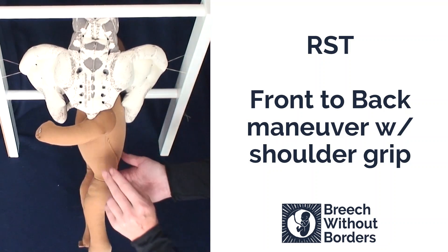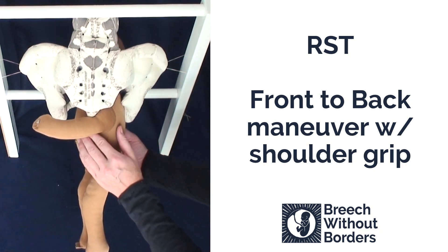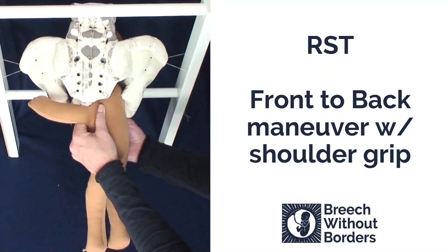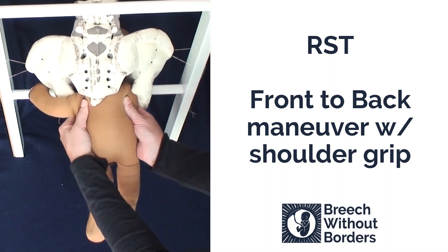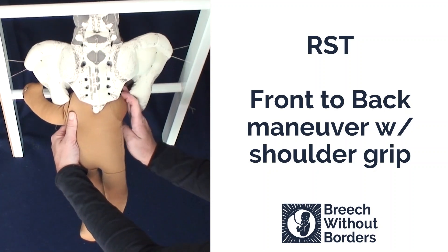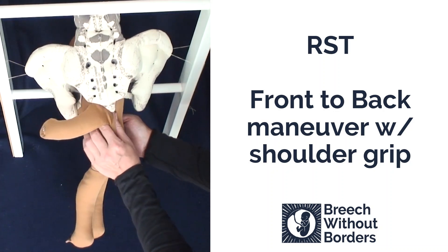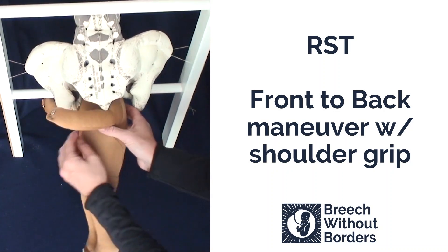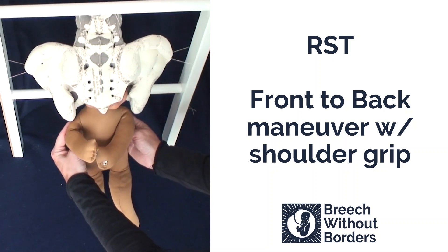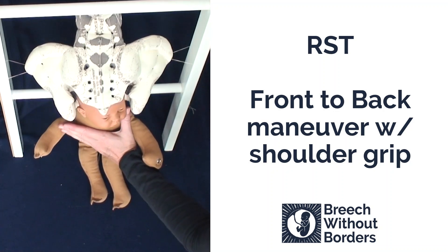Once the posterior arm is free, you can do the front-to-back maneuver with the shoulder grip. Grab the shoulders, turn 90 degrees to sacrum posterior. Sweep the baby's anterior arm down, and then rotate 180 degrees back to face you, switching arms mid-rotation if necessary. The baby can now be born. If the baby's head needs assistance, you can do a simple shoulder press.